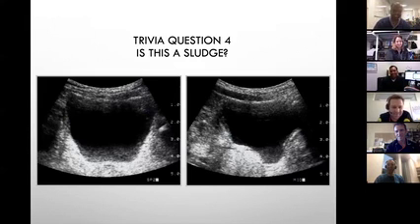Move the patient to one side. If it is a little sediment, it will layer down on the other side. If it's a slice thickness artifact, it'll still be there, doesn't matter which angle you turn. All right, just roll the patient. Always do it.